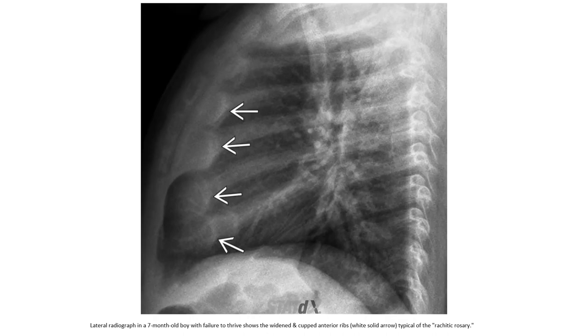Lateral chest radiograph in a seven-month-old boy with failure to thrive shows widened, cupped, and frayed ribs — the rachitic rosary.